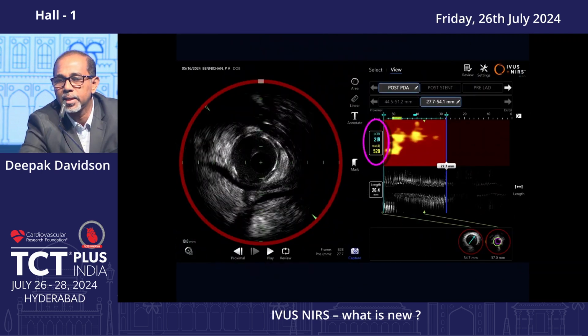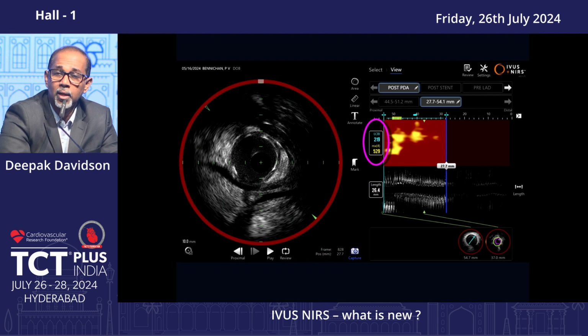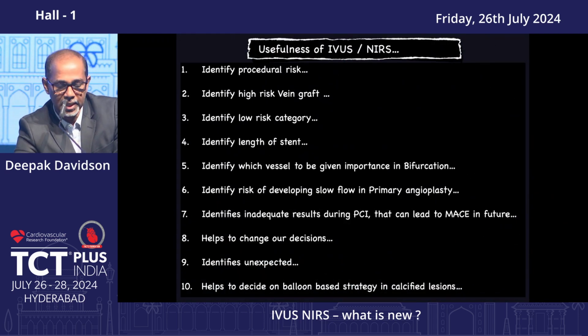However, when we did the LCBI, we found out that at the ostium of the PDA, the lipid pool was quite high. It was 529, so we decided that we'll deploy another small stent at the ostium of the PDA, and then we got away with that. That's my last set of slides.